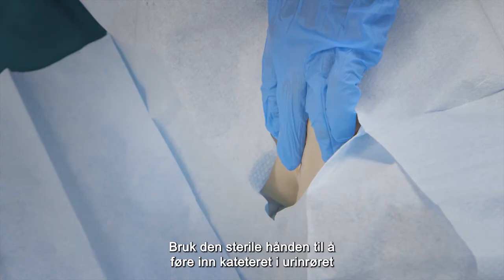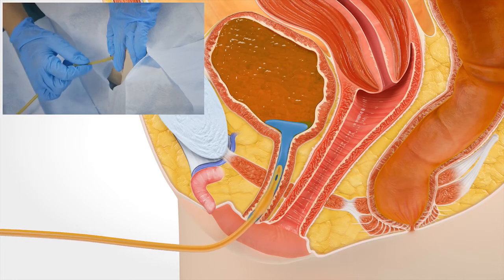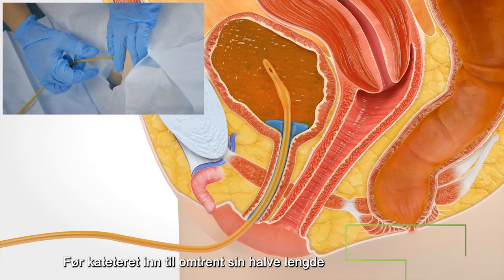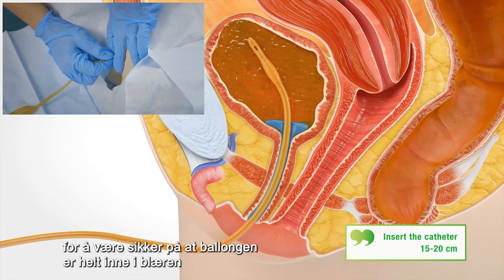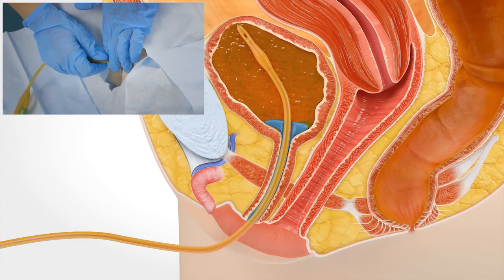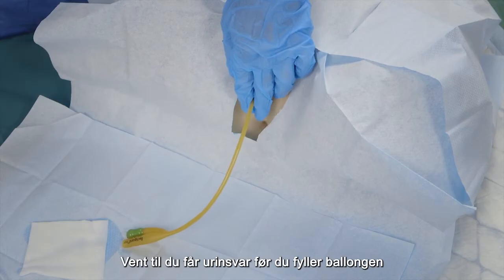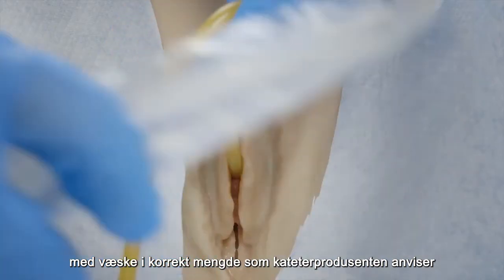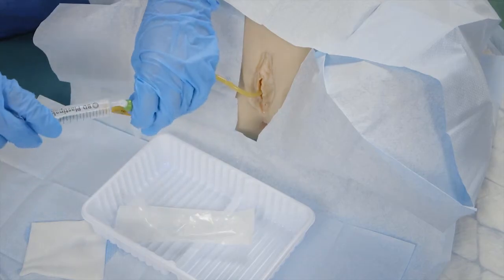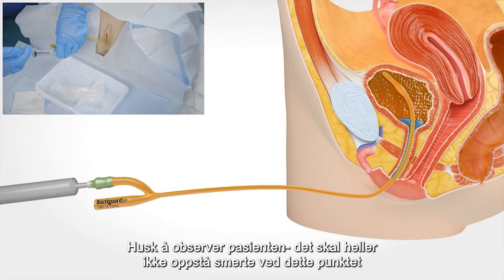Use your sterile hand to insert the catheter into the urethra — this shouldn't hurt. Insert the catheter approximately half of its length to make sure the balloon is all the way in the bladder. Get some urine in exchange before you fill the catheter balloon with the fluid and precise amount that the catheter producer recommends. Remember to constantly observe the patient; this step shouldn't hurt either.